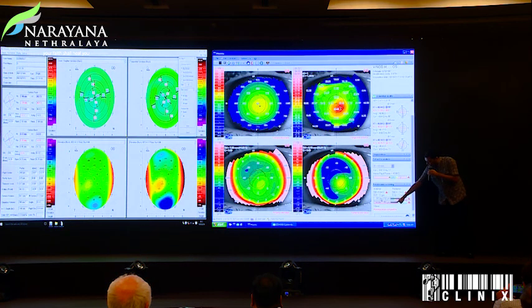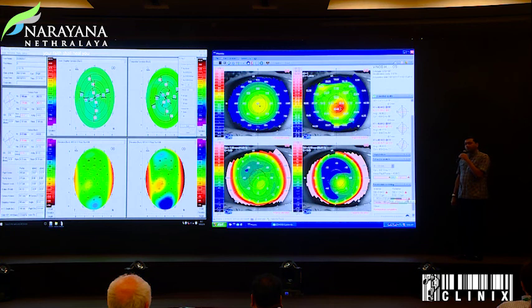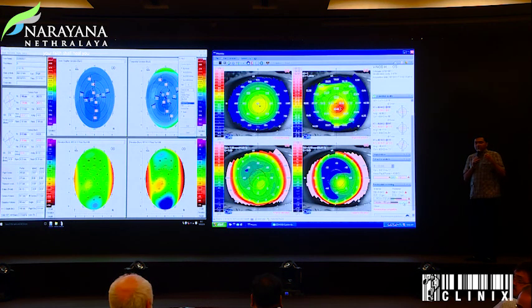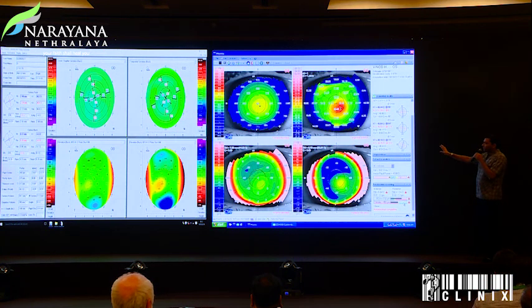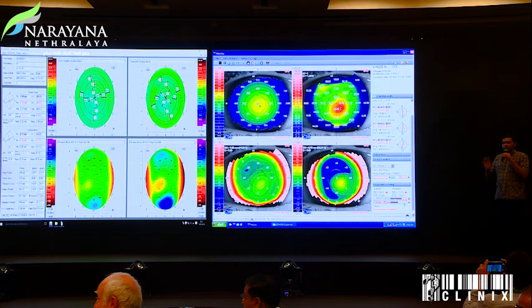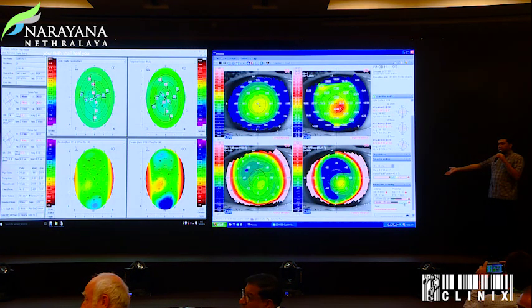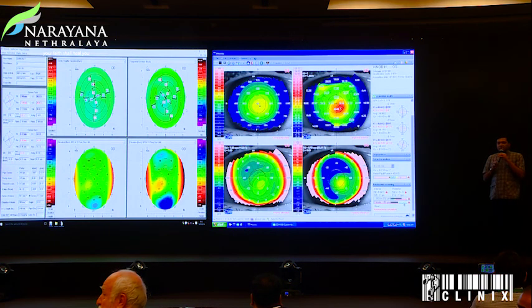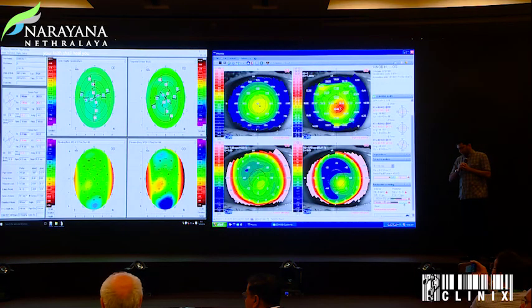If you go back and close that, it gives you the lock axis. One of the most important things, especially if you are doing a multifocal, is the BCV. There's a BCV here which tells you the aberration irregularity — nothing but how the cornea is aberrated as a whole. It is not taking one point; it gives you the entire overall picture, and you can see that these black bands are always outside it. Dr. Pahujja is here — I think he is one of the most meticulous IOL surgeons in Pune. Which part do you use when calculating for your IOL?